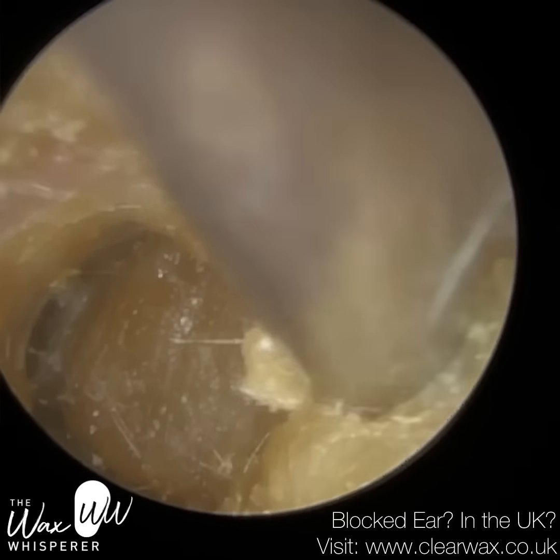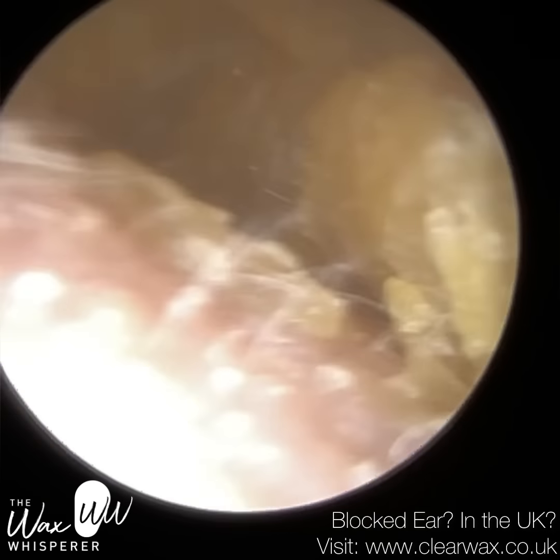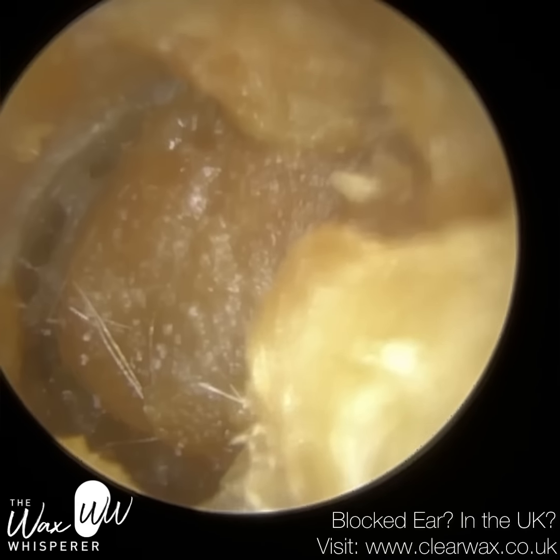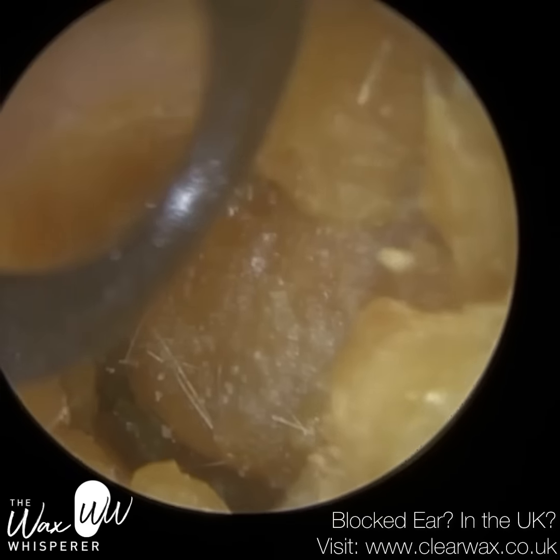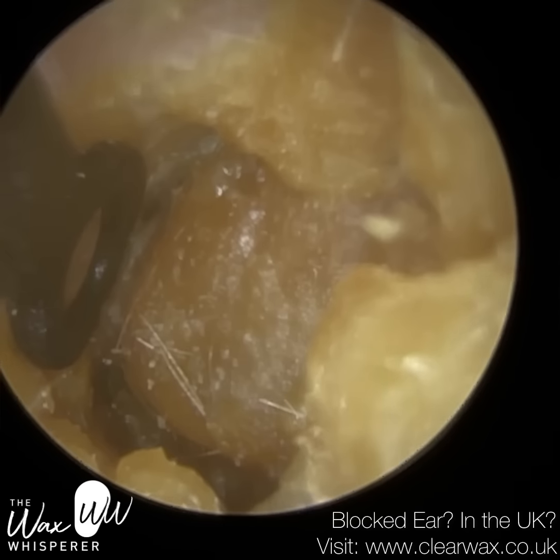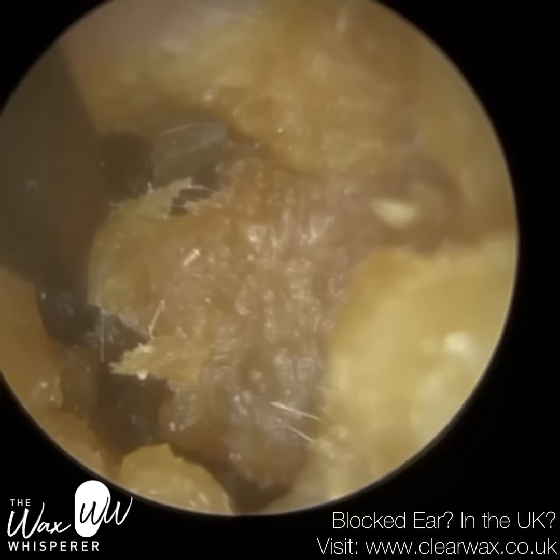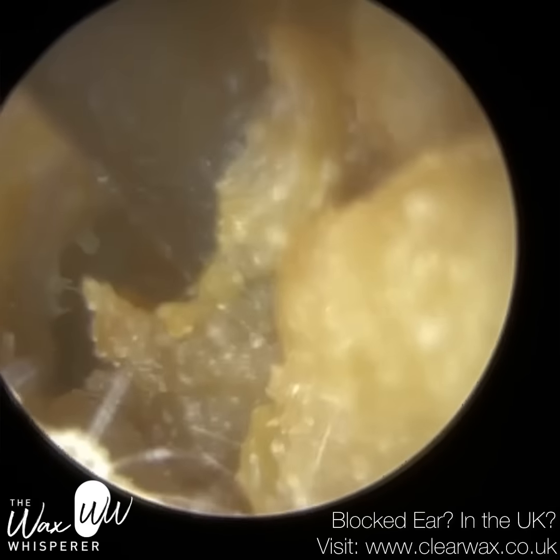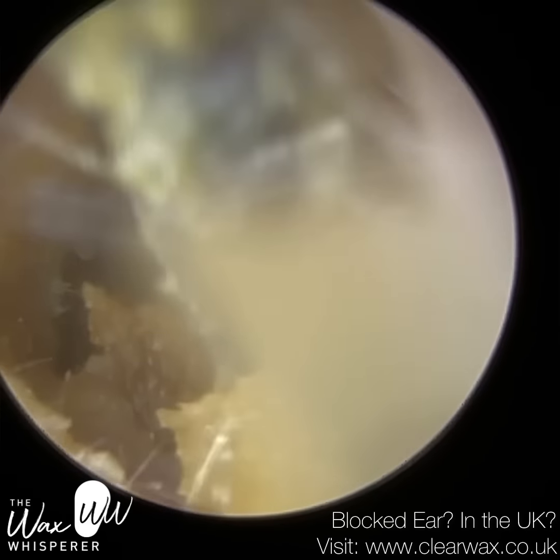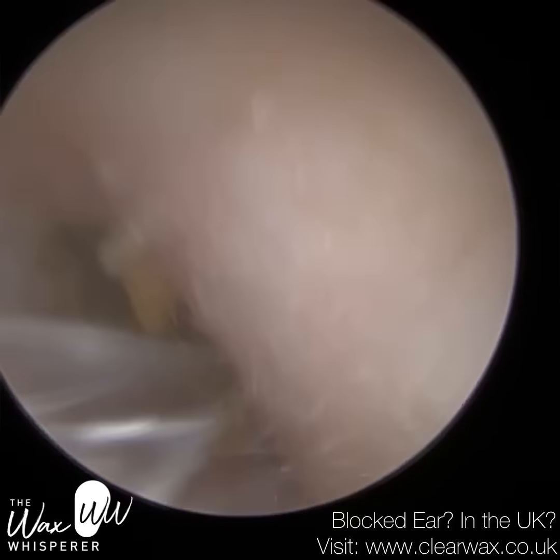So here there are different consistencies along the plug of keratin, and there's an opening at the roof of the ear canal. Because this was so adhesive, I thought, let me get the Rye curette. You can see I can glide it really deep, but as I was extracting it, the patient found it really uncomfortable, and I wasn't in contact with the canal walls. You can see that there, I was right in the middle. And so I stopped using the Rye curette as a result.